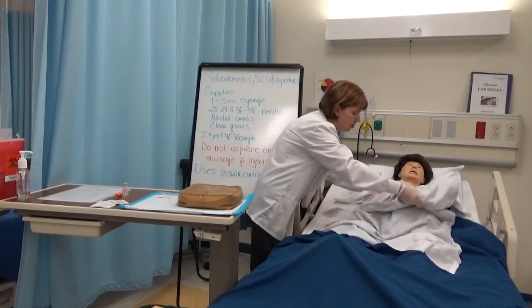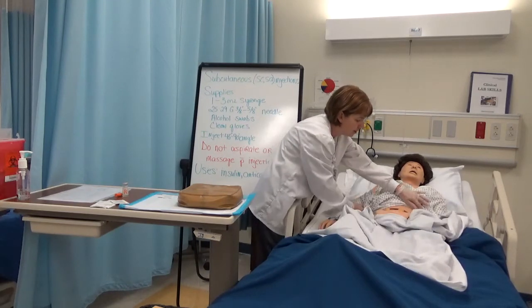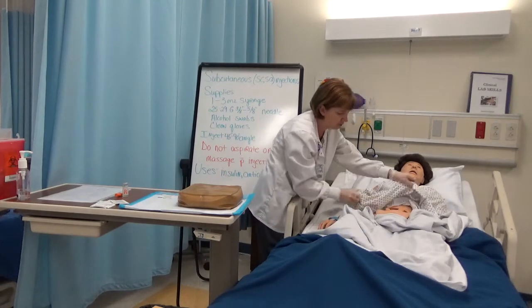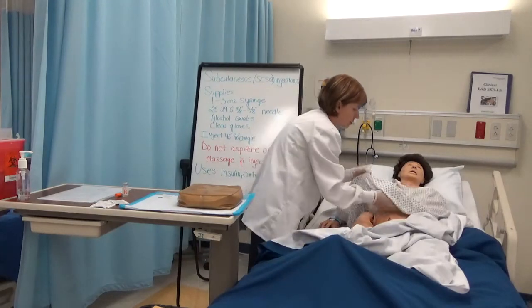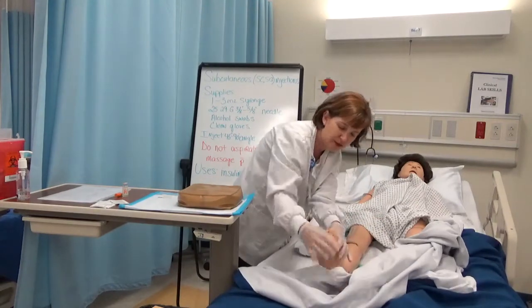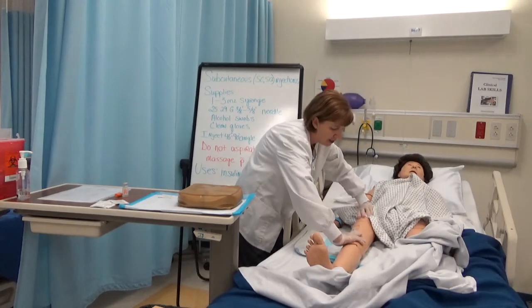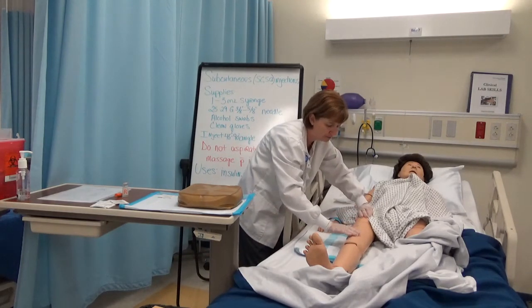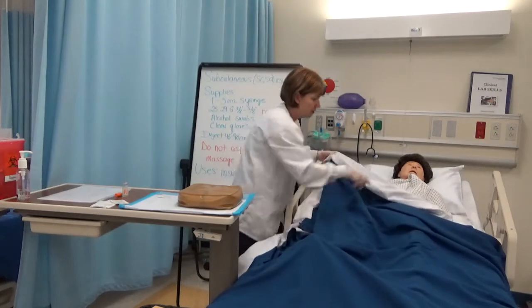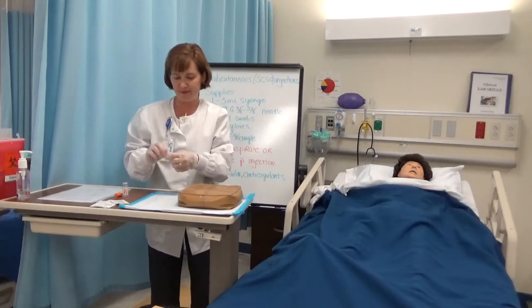The other site, which I'll use today, would be the abdomen, and I would locate the umbilicus or the belly button and just make sure I stay an inch away. And then the other site could be your patient's leg. And for that site, I'm going to put a hand below the greater trochanter and a hand above the knee, and I would go right on top of the thigh. Okay. For our demonstration today, we'll use the pad up here on the table.